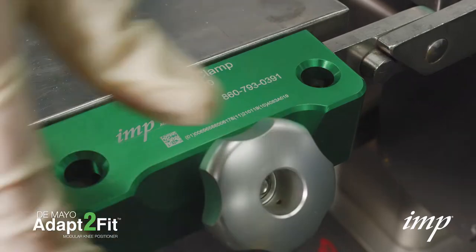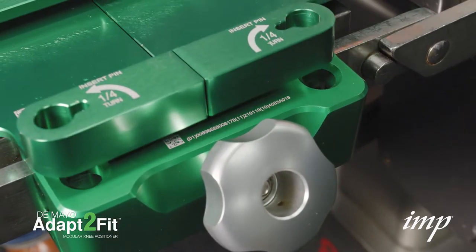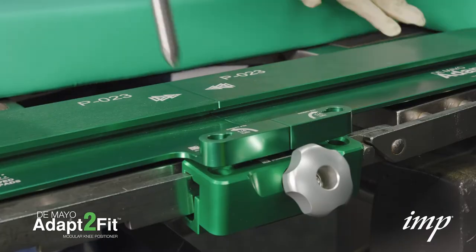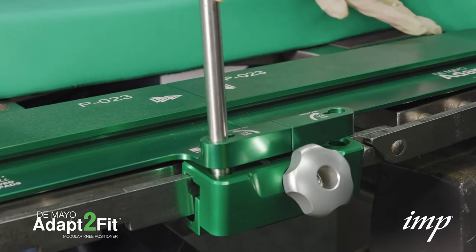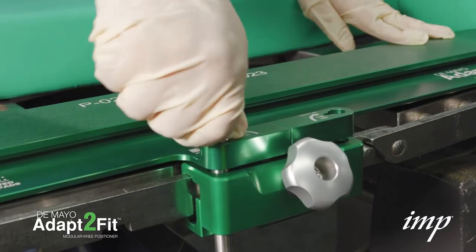Position the quad clamp directly under the holes in the base plates in accordance with the quad clamp IFU. Insert a guide pin so that the protruding pin fits into the keyhole and goes into the clamp, then turn it a quarter turn following the arrow on the base plate.